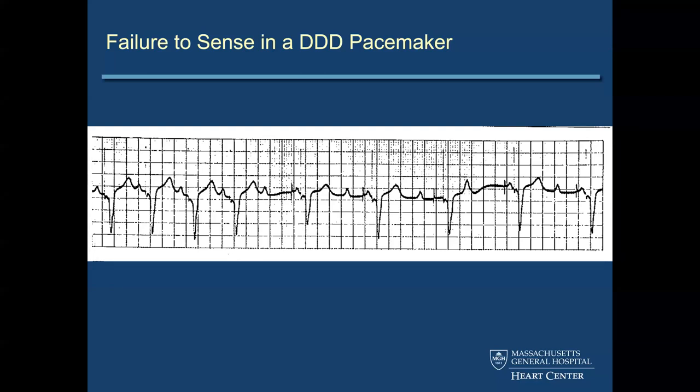Lee and Dr. Ijeoma. So my challenge is that I understand the first four EKGs: we could see atrium, there's no spike, so atrial sensing. Ventricle, there's a spike before it, so ventricular pacing. But the fifth one, we can see the P wave. Maybe it's just a bit too close to the T wave, and there's no QRS. So even though we can see a P wave, are we saying that there's no atrial sensing? I think I can see a P wave, so I'm thinking there's atrial sensing. Is it because it's closer than the other three ECGs that we say it's not sensing?